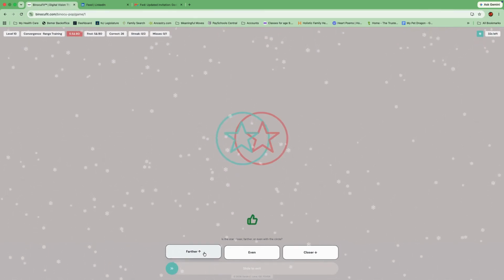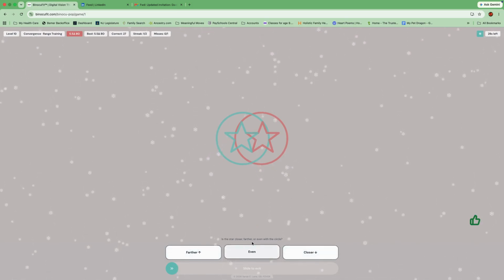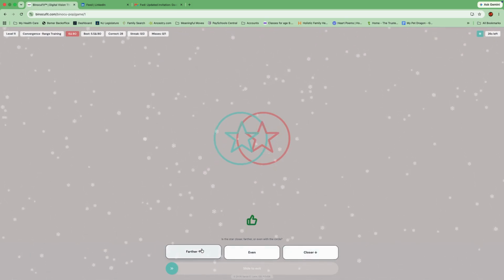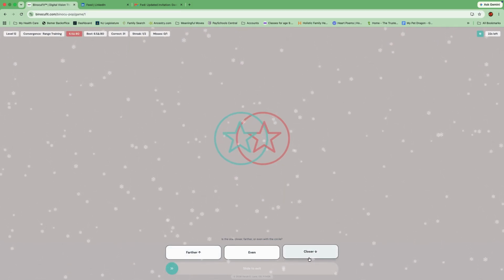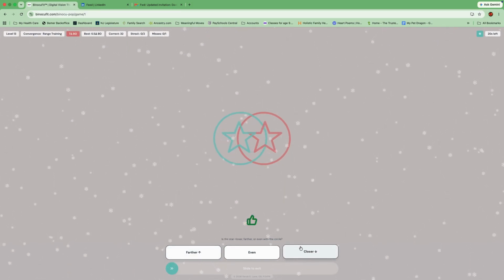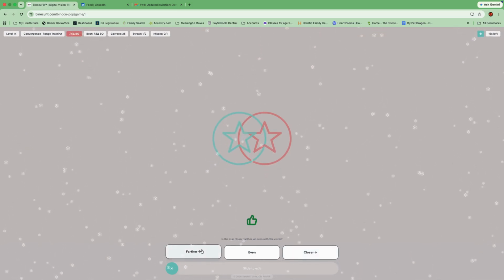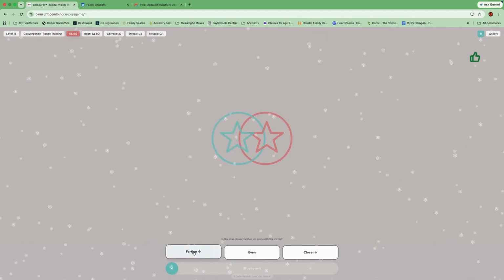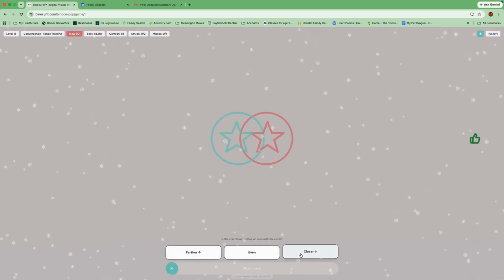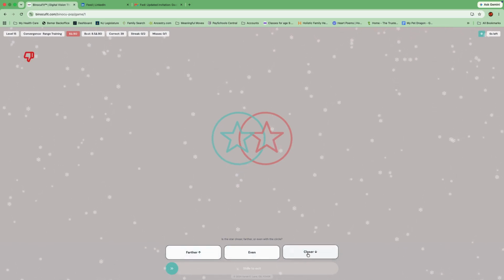So keep working through the activity and notice again that those little indicators in the side vision, the thumbs up or thumbs down, are just another way of expanding out the periphery, making sure we're not locking into too much of our central vision as we're trying to balance everything out here and develop coordination of our two eyes in the context of how we might use them out in the real world, which is not only looking at a computer screen, but noticing everything going on around us as well.